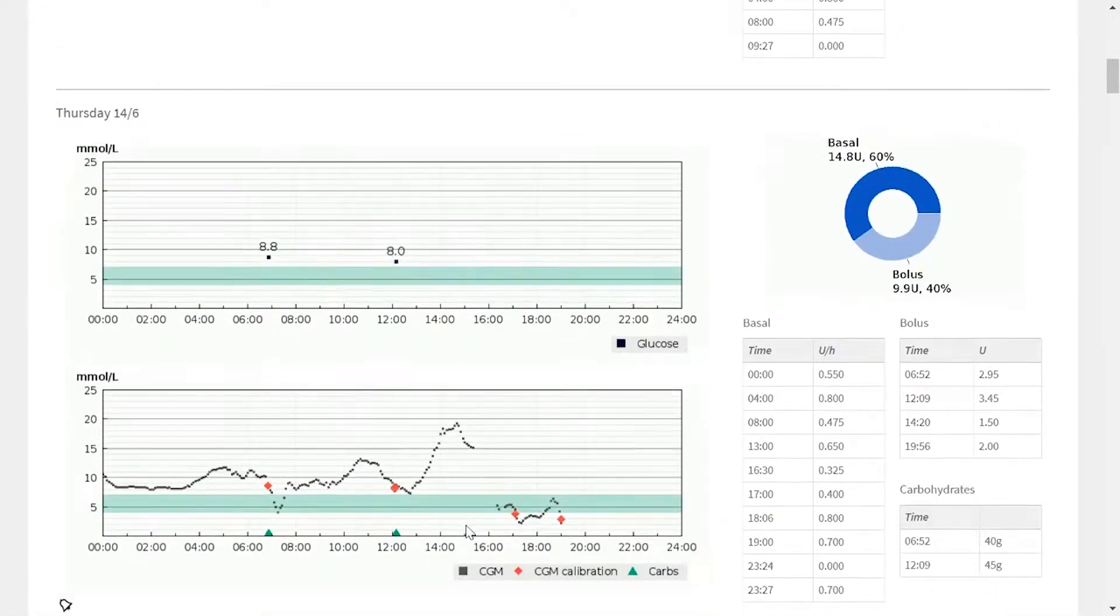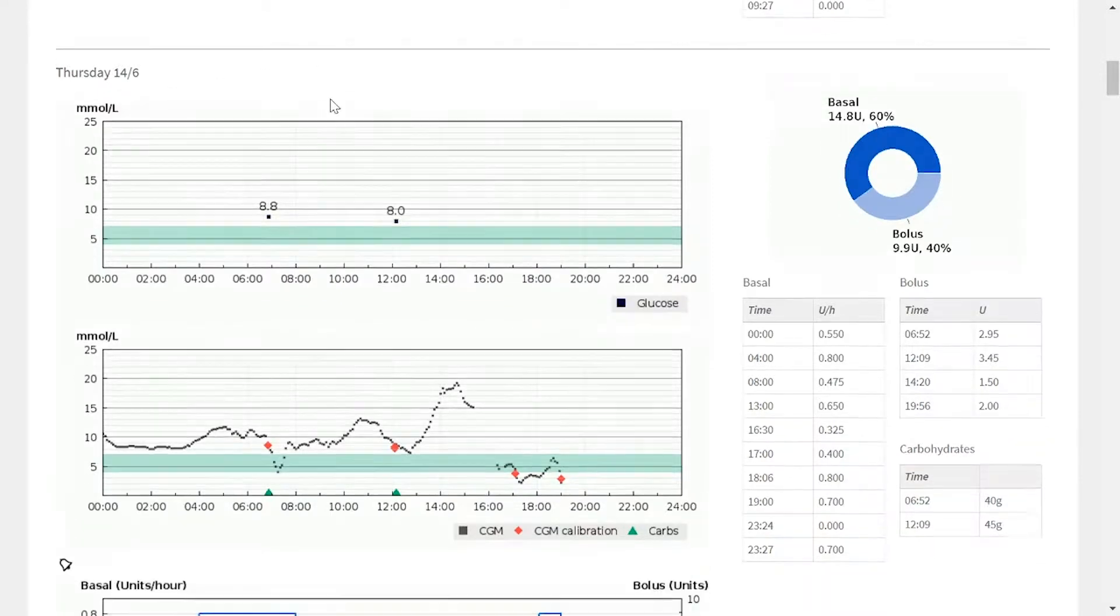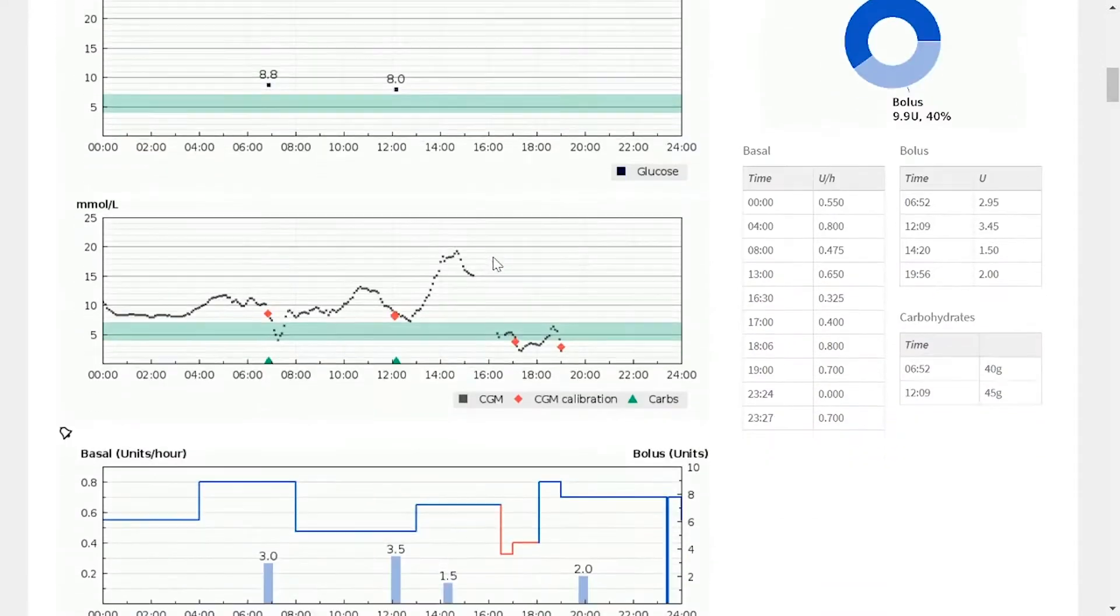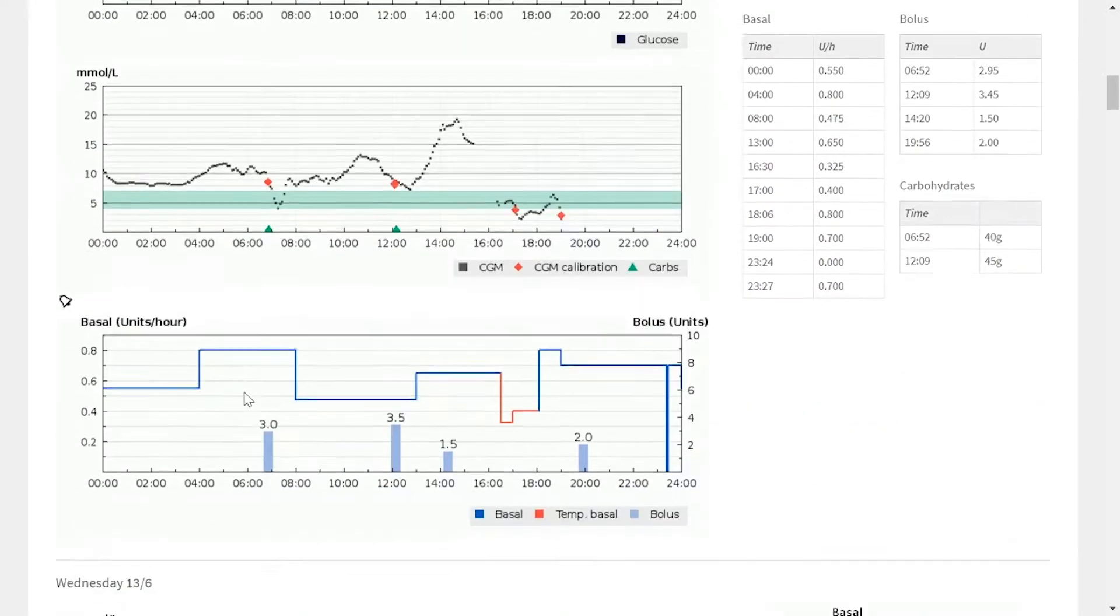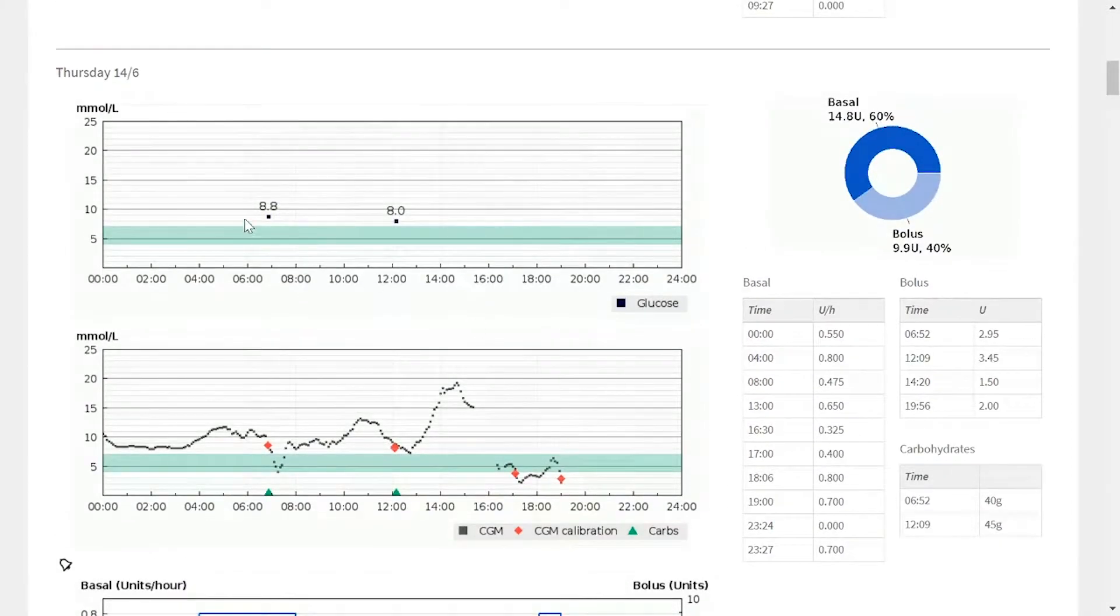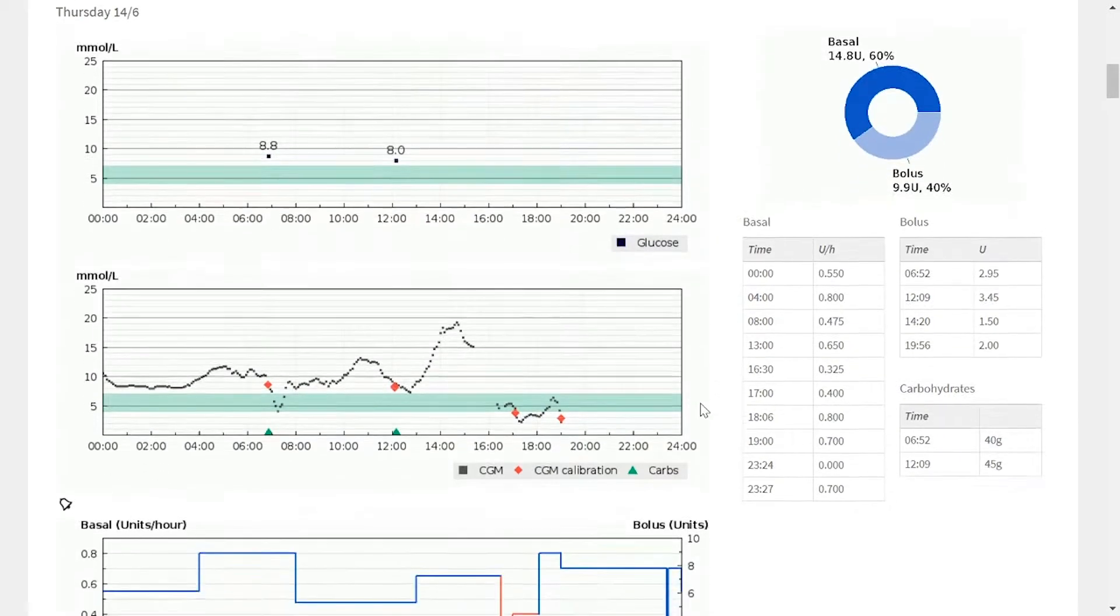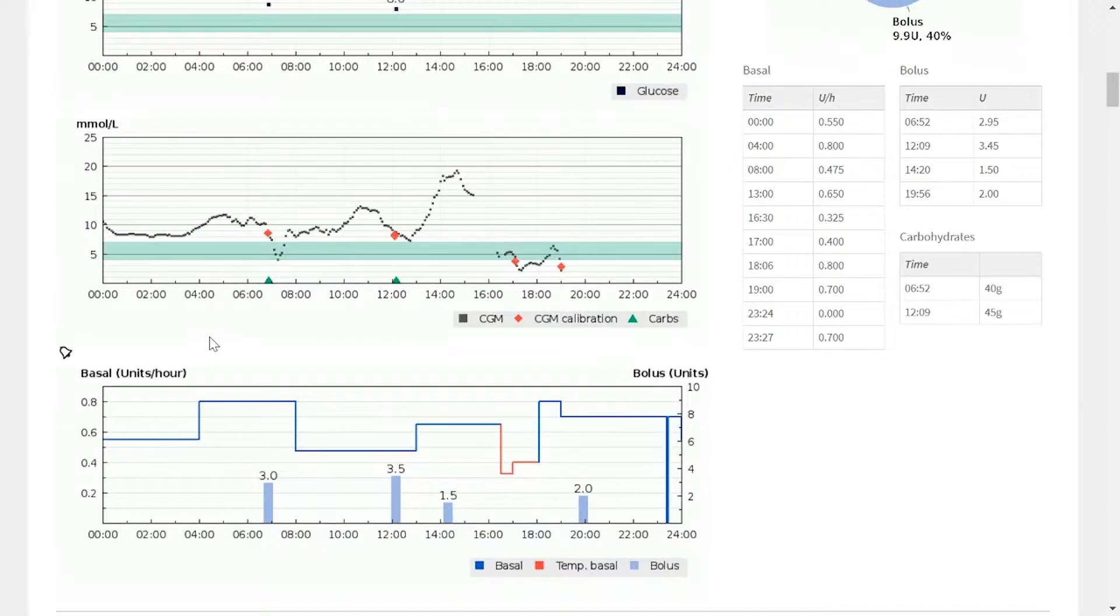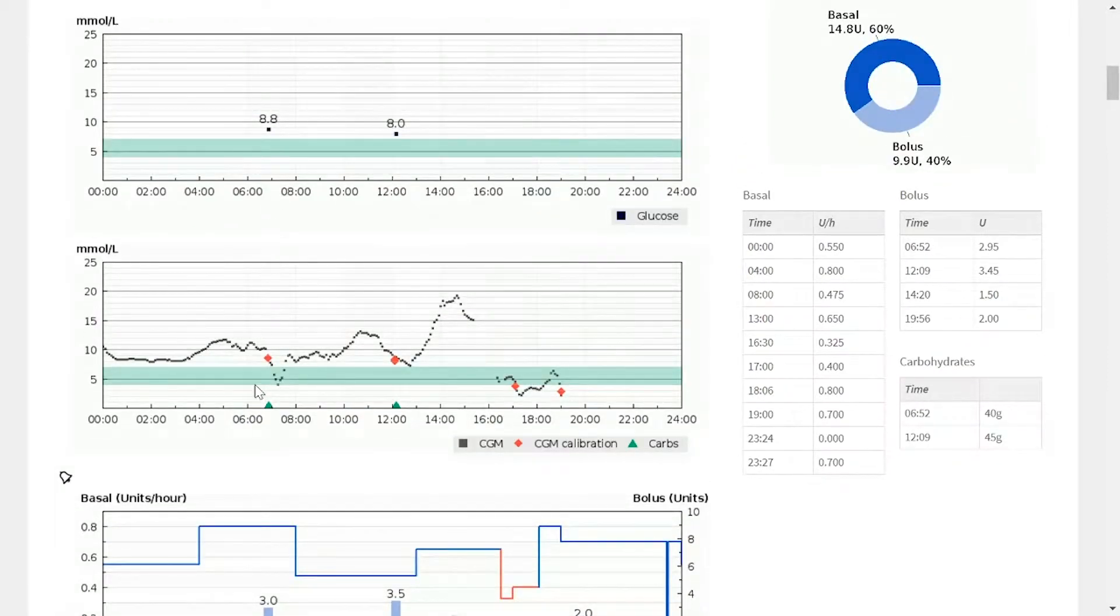So as I scroll down you'll see for instance for Thursday the 14th we have the blood glucose graph, we have the CGM graph and we have the insulin pump graph. On these graphs we're able to see that the timeline across the bottom is actually the same for each graph, which in practice means that all the events line up time wise.